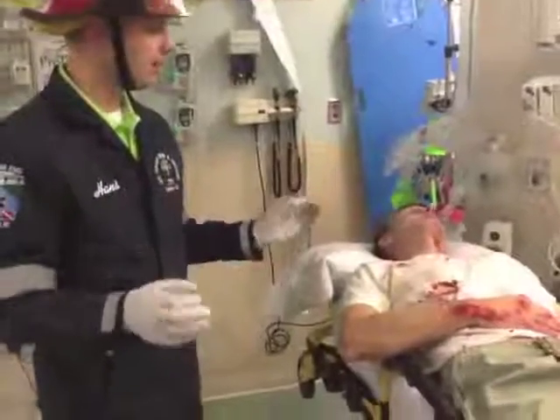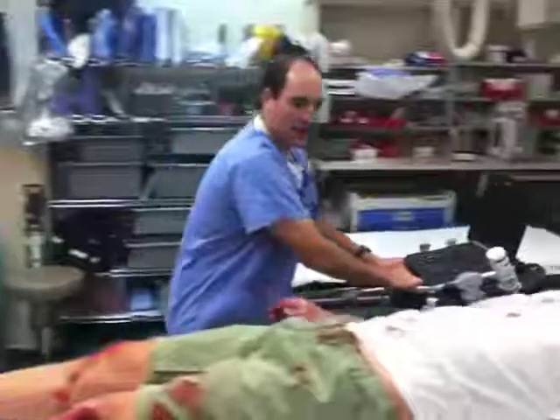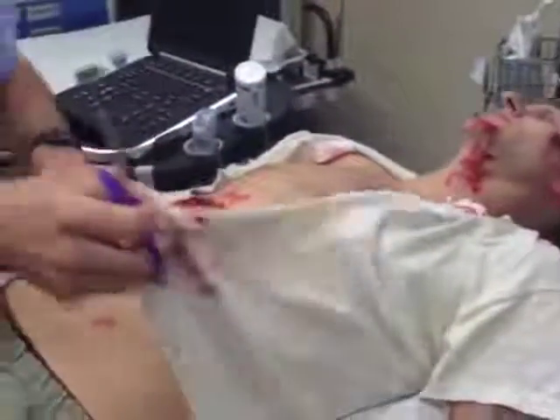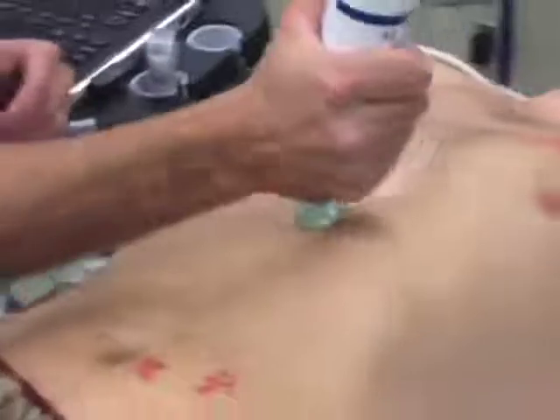Bad bike accident picked up in front of the hospital here. Okay, we need an IV, O2, monitor going. Can you come in here and do an ultrasound? Sure, Dr. Zwank. I got this. Start with the gel in the epigastrum. First to the right upper quadrant.